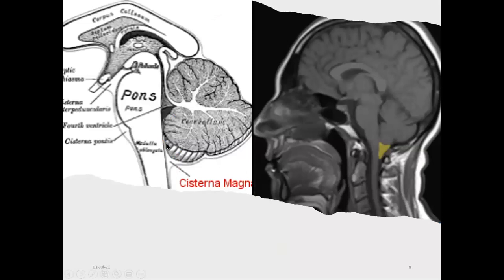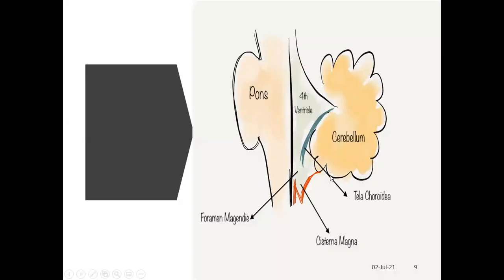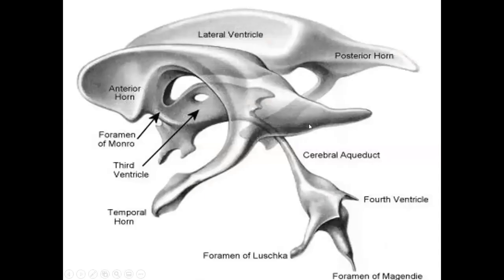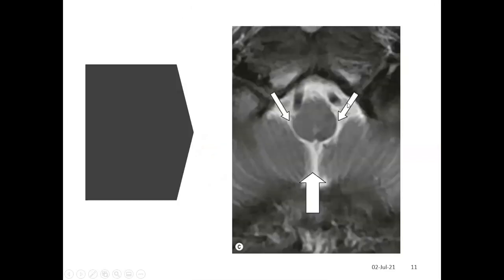The cisterna magna is the space between the posterior surface of the medulla and the anterior surface of the cerebellum. Here you can see the foramen of Magendie, the floor and roof of the fourth ventricle, the foramen of Luschka (lateral), and the foramen of Magendie (central), with the two foramina of Luschka on each side.